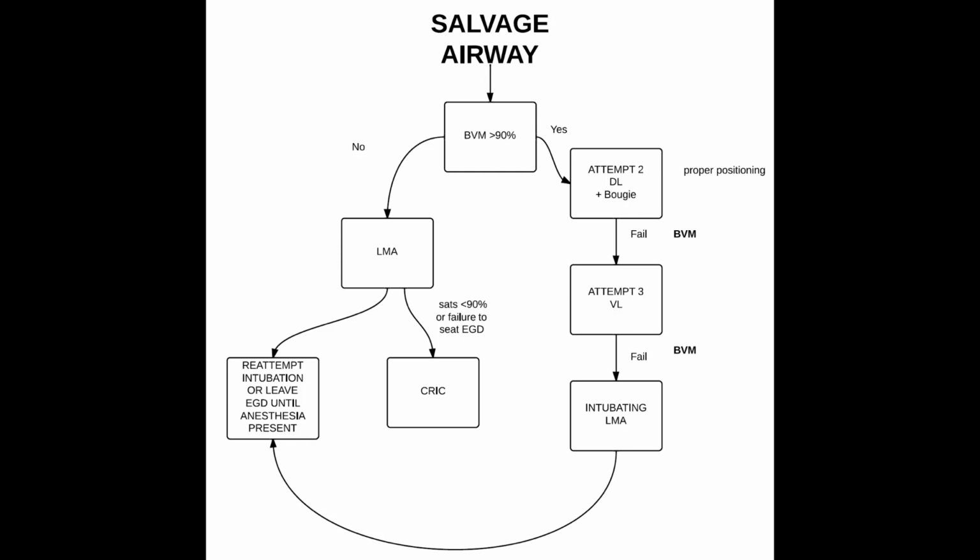If it's still falling, next step is cric. Ultimately, if you're not prepared or have not made the decision in your mind prior to starting the intubation that you may end up doing a cricothyrotomy, do not push the rocuronium. You're just not ready. Take the time and palpate every patient's cricothyroid membrane, because ultimately that's going to be your big safety umbrella if all of this fails.